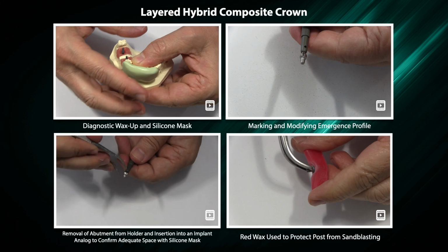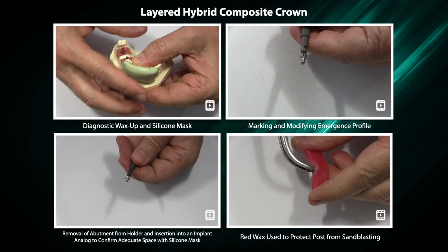Removal of abutment from holder and insertion into an implant analog to confirm adequate space with silicone mask.